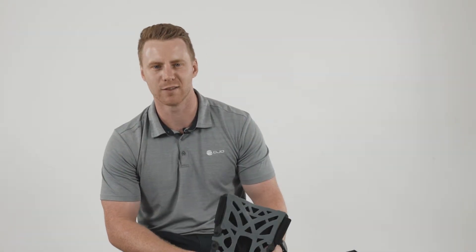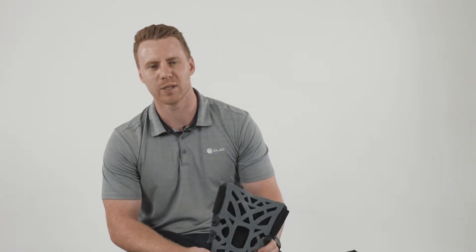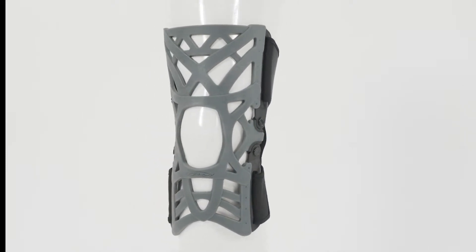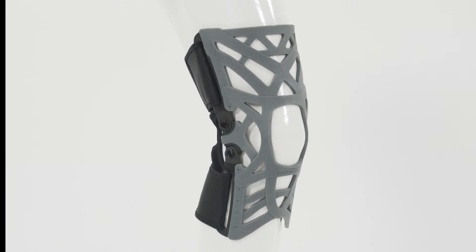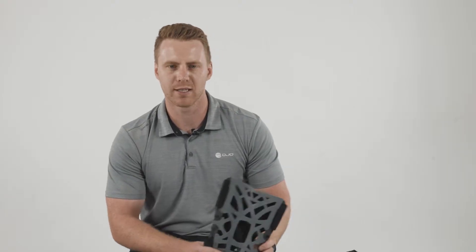Hi, my name is Andrew. I'm a registered physio and territory manager in New Zealand for DJO. One of the more unique knee braces that we manufacture is the Donjoy Reaction Knee Brace. This is designed specifically for anterior knee pain or patellofemoral joint pain and any proprioceptive deficits after somebody has had a knee injury.